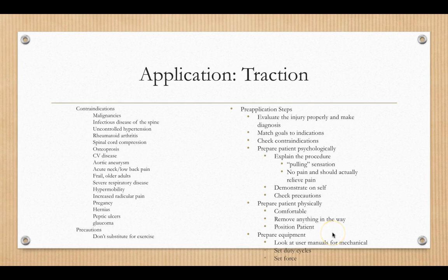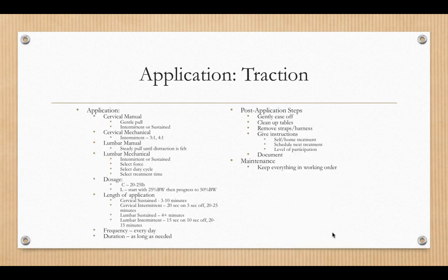When we position our patient too, again, thinking about that, you want to cradle the head. We might want to flex the head to open that up maybe 20 to 30 degrees. Again, making sure with the lumbar, if we're doing the leg pulls, that we're in the right position. That unilateral leg pull has 30 degrees of abduction, about 30 degrees of hip flexion, and maximum external rotation of the hip. And then, again, on the tables, making sure that you set the tables appropriate for the individual.